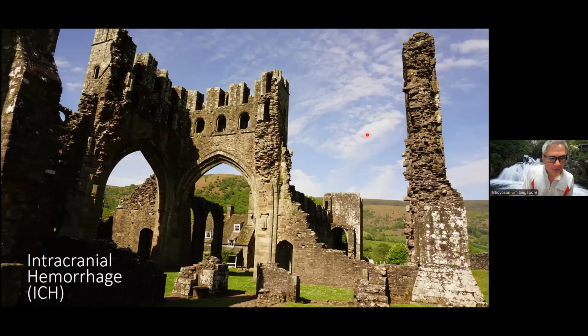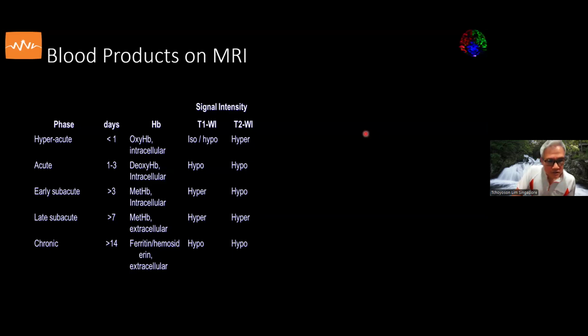So to recap, arterial infarction presents clinically, very strikingly, very typically, and far more often than venous sinus thrombosis, which is very difficult, even in the best hands, to make the diagnosis. Now let's talk about intracranial hemorrhage. Intracranial hemorrhage, the appearances of blood products, hemoglobin breakdown products on MRI is very complicated.